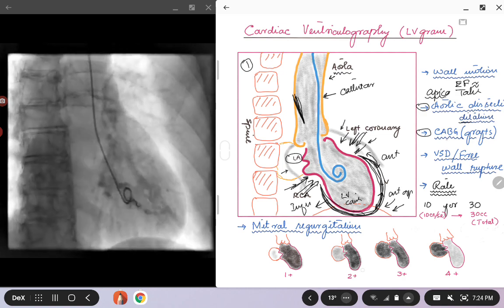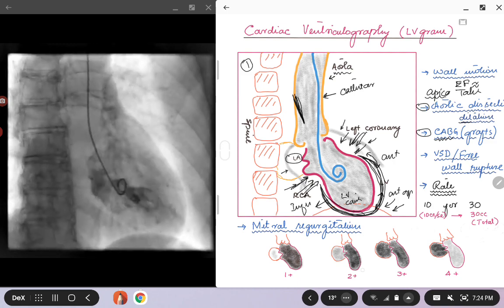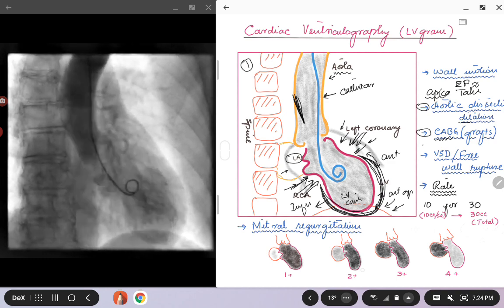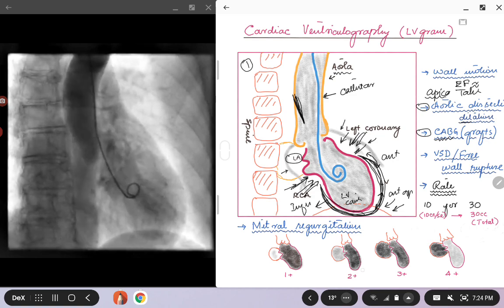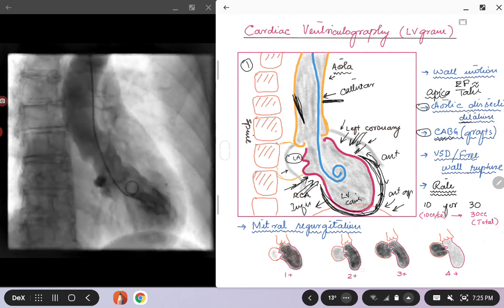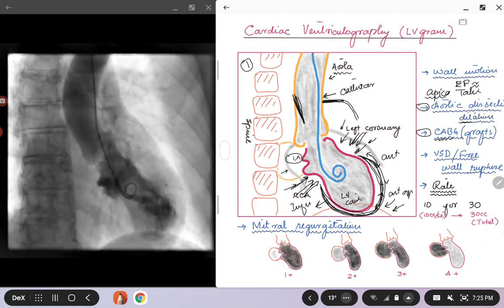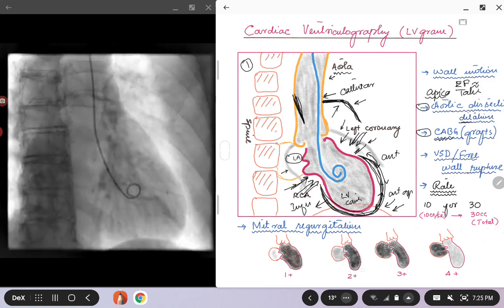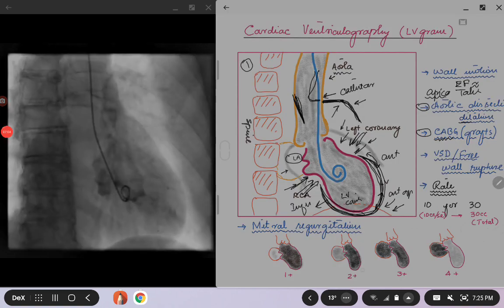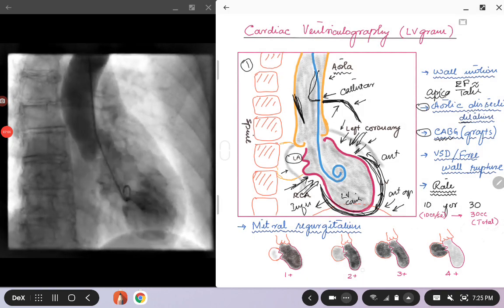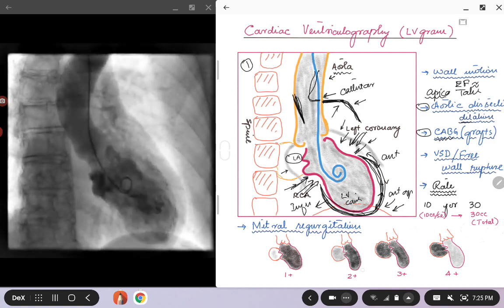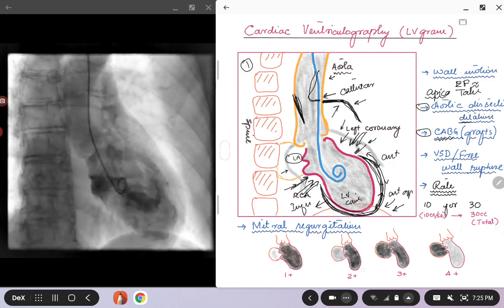The third thing you can see is that when you do an LVgram it also opacifies the coronary arteries. Sometimes if you have patients with a CABG and you don't know the anatomy of the grafts and you're not able to find the graft, you can do an LVgram and see the bypass graft arising from the aorta and going to the heart. You can get an idea of where that graft is coming from and then selectively engage it with a catheter. Basically, if you're not sure about the graft anatomy, this can also help you localize the graft in patients who have coronary bypass grafts.